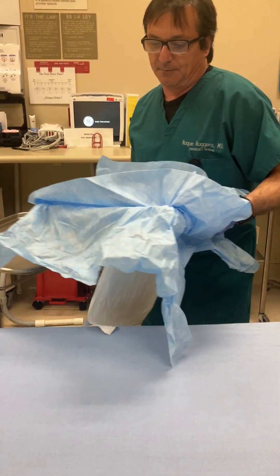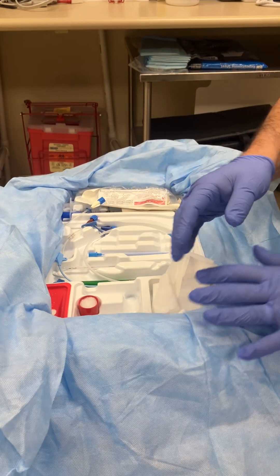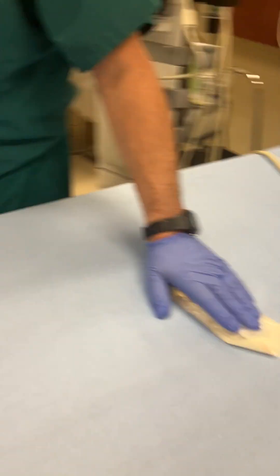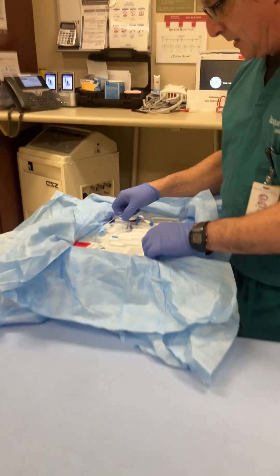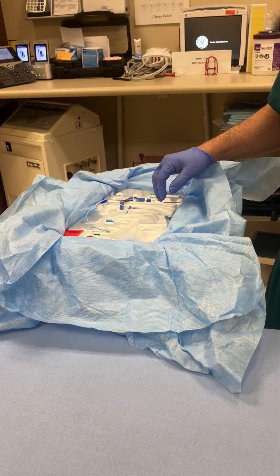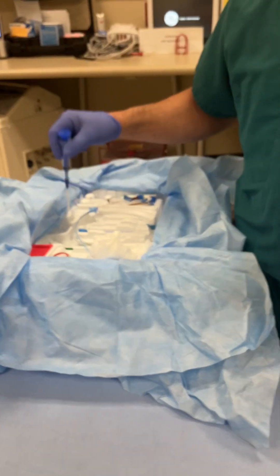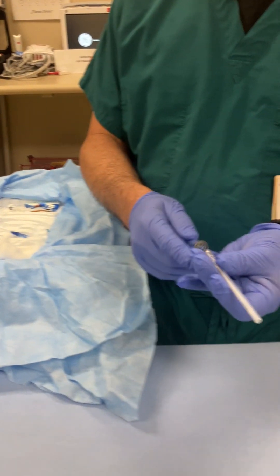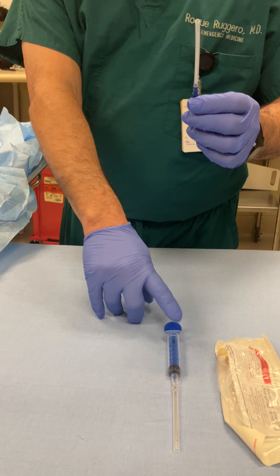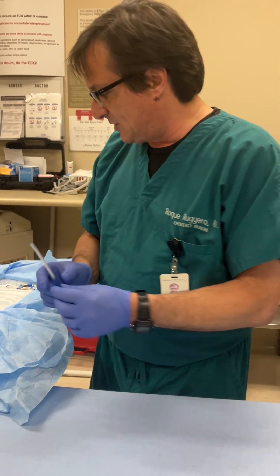I'm going to place the equipment here. I usually keep things in the tray until I need them, but I'll take things out so you can see what we're doing. We're going to start by using chloroprep to clean the skin. If the patient was awake and conscious, we might use lidocaine as well. The first thing is the introducer needle, which is a large gauge needle. At the end, I'll explain how instead of using an introducer needle, there's also the option of using a catheter to place the central line, and the technique is just a little bit different.